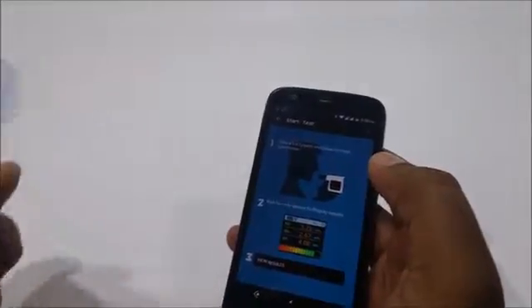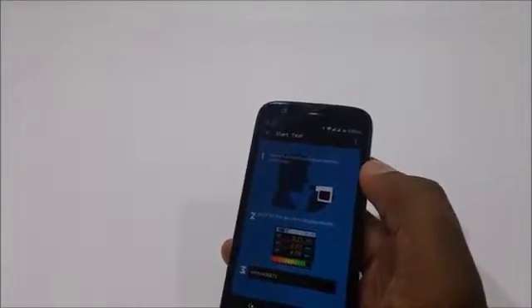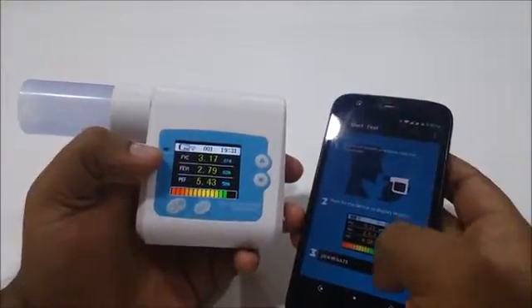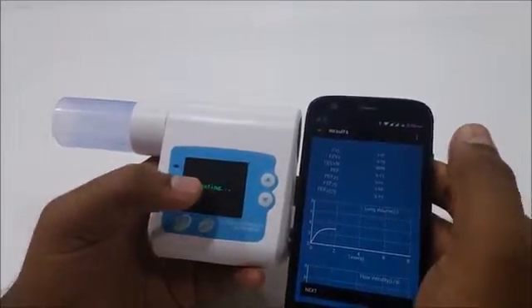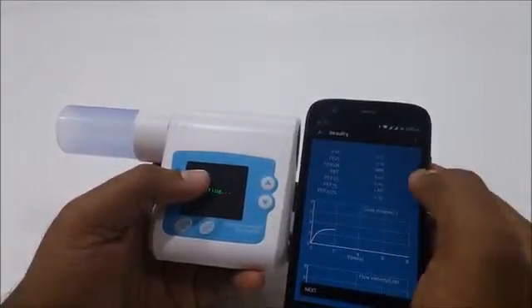I continue, and then I take a full breath and blow into the spirometer. Once I get the data, I can go on to view results. The moment the data gets pushed from the spirometer to the app, it gets wiped from the device itself.